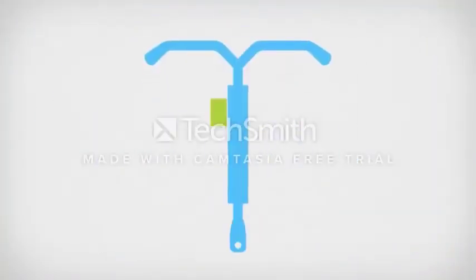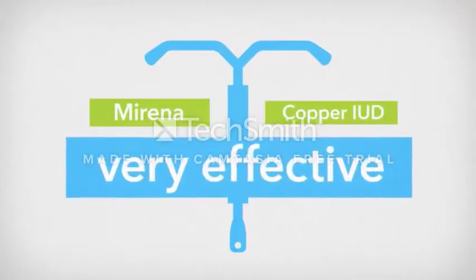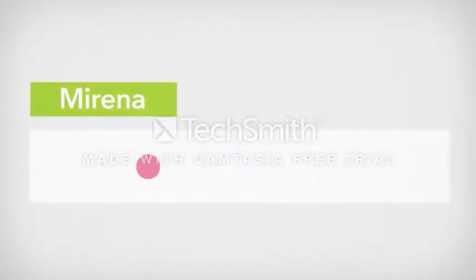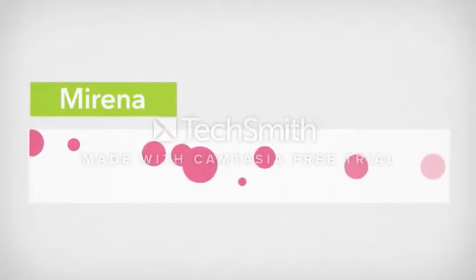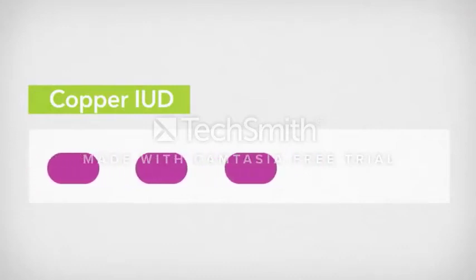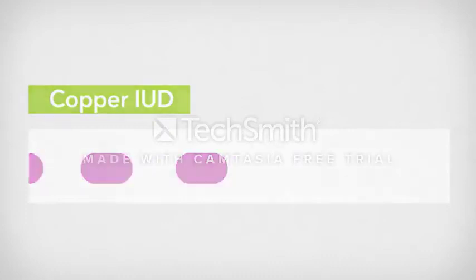In summary, the Mirena and the copper IUD are both very effective methods of contraception. The Mirena will generally make the periods lighter and may stop them altogether. Irregular bleeding in the first 3 to 6 months is common. The copper IUD contains no hormones, can be used as emergency contraception, and generally doesn't affect the regularity of periods, but they may become heavier, more painful, and last a little longer.